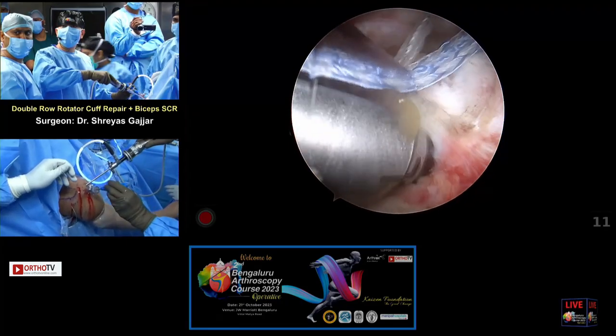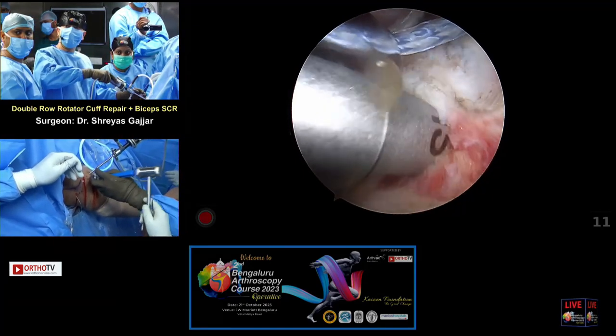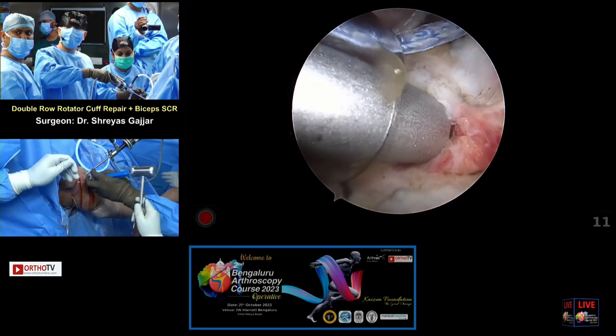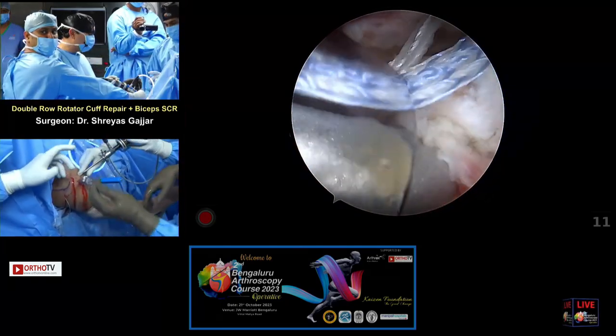Stop. Okay, hammer. No, it's not over, sister. I want to see the mark. Slowly, please, sister, slowly. Keep going. Little more. Okay, fine. Can I have the anchor, please?